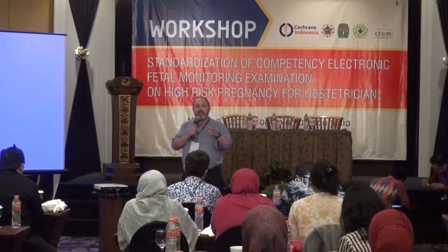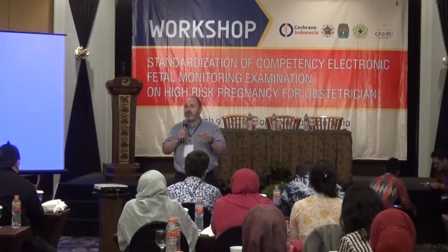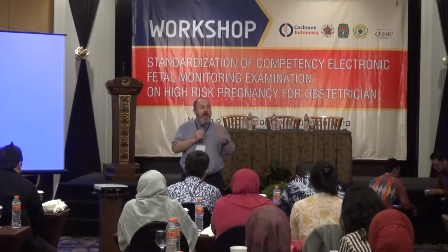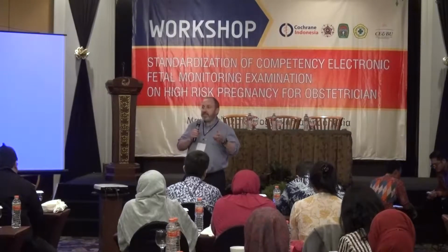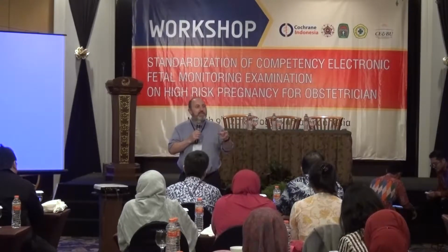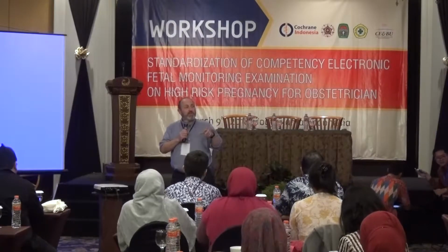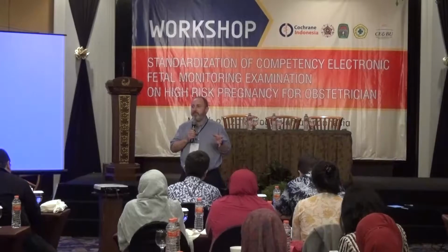When we talk about early decelerations, early decelerations are caused by stimulation of the parasympathetic nervous system, which causes a decrease in the fetal heart rate. It was mentioned this morning, when do you most often see stimulation of the parasympathetic nervous system in the fetus during labour?